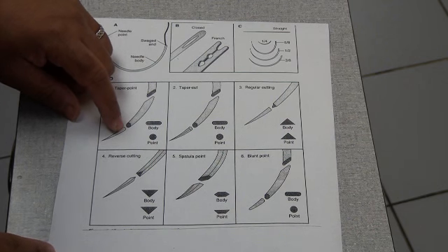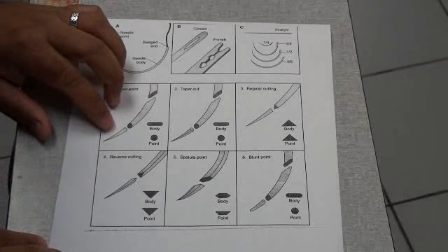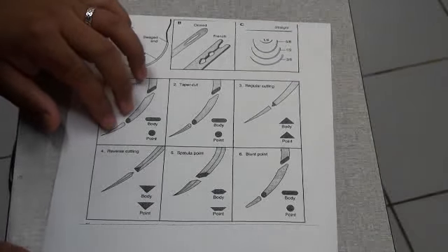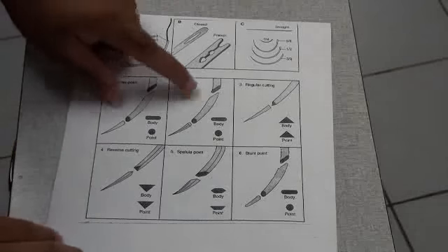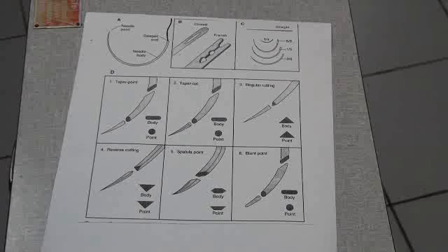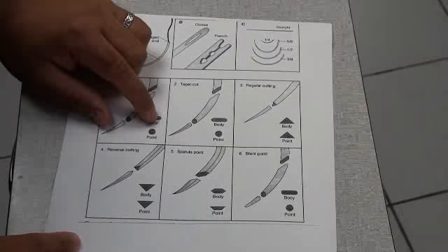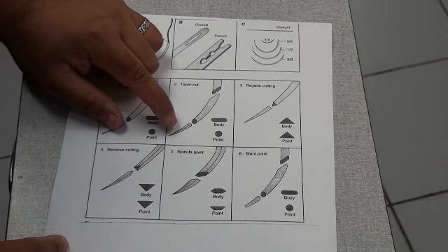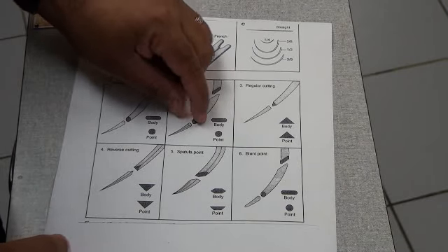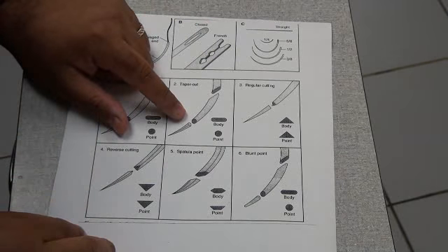It's best used when a sealed suture line is needed, like suturing an intestine or other hollow organ. It can also be used for fat and muscle. A taper cut needle here does have a sharp point, but it also has 3 cutting edges that taper away into a round body. The needle is used for tough fibrous tissue and some cardiovascular procedures.